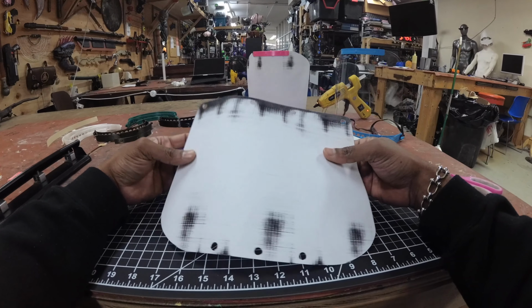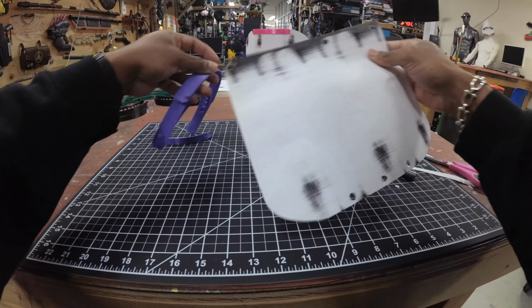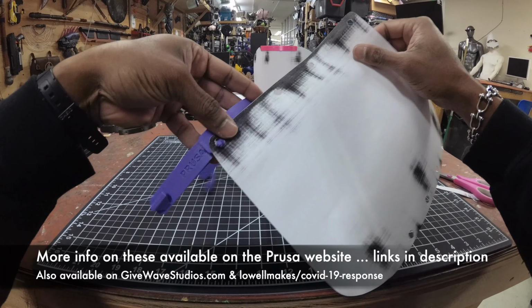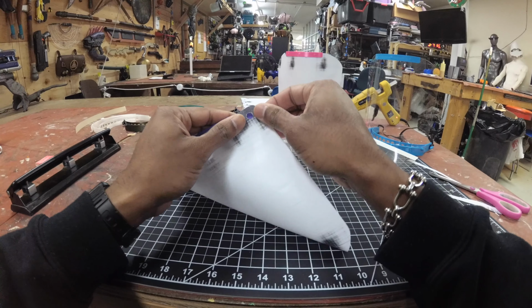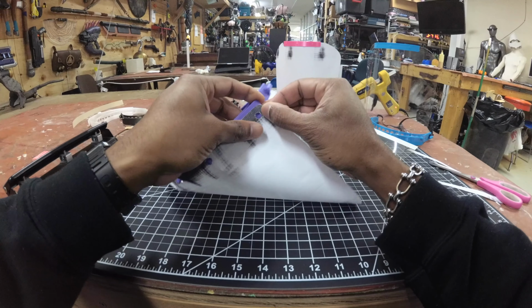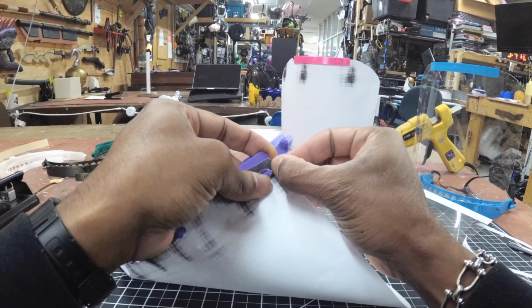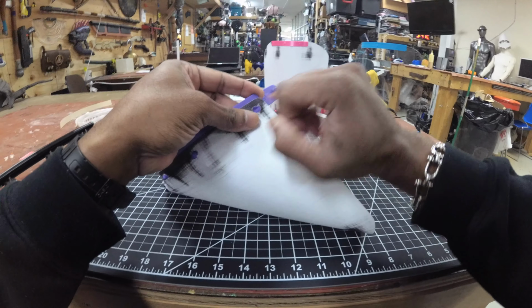And once you have all of the holes punched out in your paper pattern, go ahead and grab your 3D printed piece. And I'm just going to slide one piece in. Just going to place them on the nubs as they fit. And then on this last one, you're going to push the 3D print out so that it can slide in.